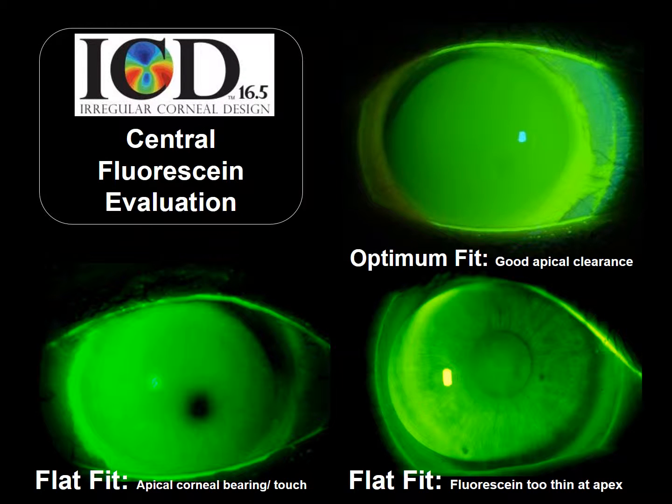These lenses are assessed using fluorescein evaluation, so lenses should be inserted filled with saline with a drop of fluorescein so you can assess the fit with a blue light and Wratten filter. The optimum fit will show good apical clearance, and in fact clearance over the entire cornea including the limbus, as shown in the upper right photo. If the fit is flat, you may see apical corneal touch or bearing, or simply too thin a layer of fluorescein over the entire lens. Both of these will require a steeper sagittal depth.